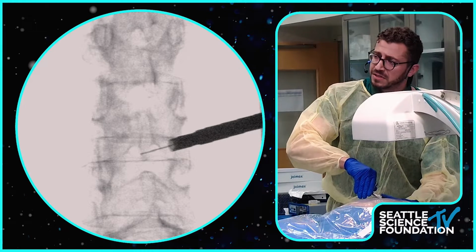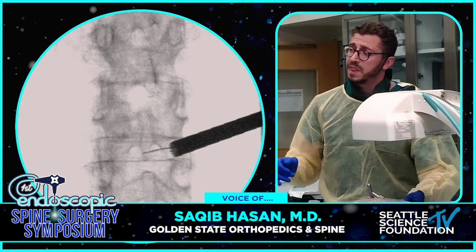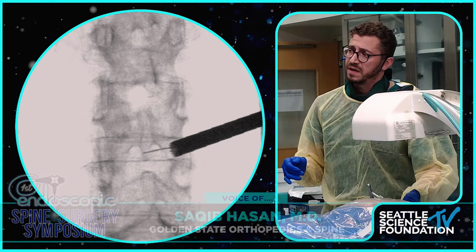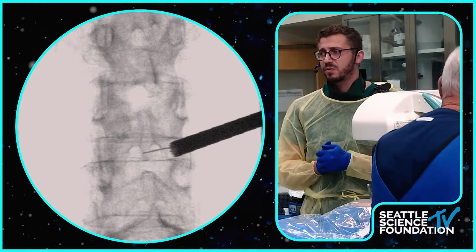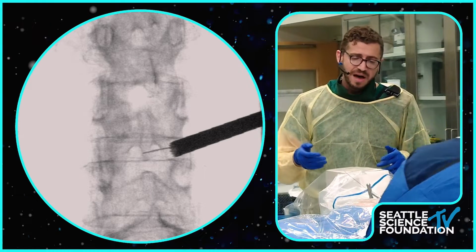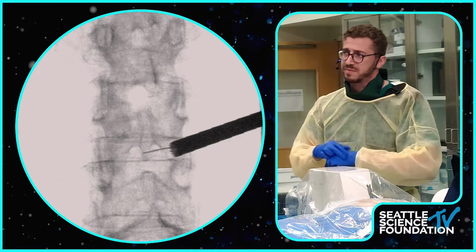X-ray, please. Osama, for that guide wire that you have there, for the new attendees who haven't done this before, is that ever concerning, or do you know that's in a good spot? If I wasn't sure, then you get a lateral. So could you get a lateral, please? The lateral would show us that that is probably either in the disc space or in the epidural space. Obviously, if this looks like it's in the canal, then it would be worrisome for sure.